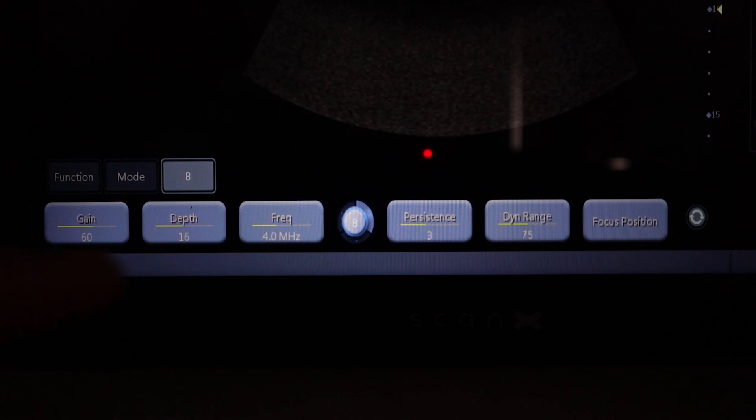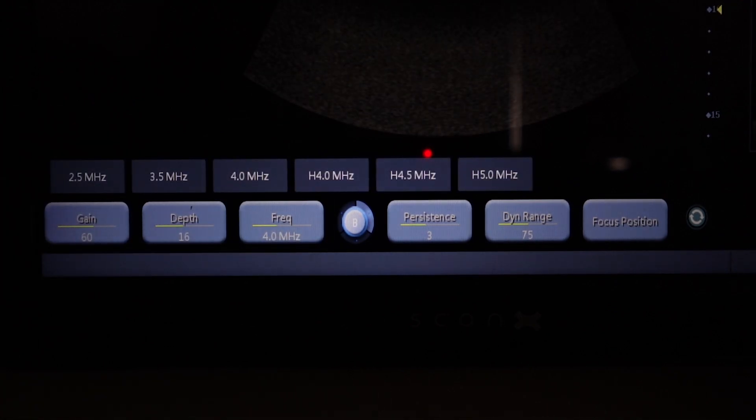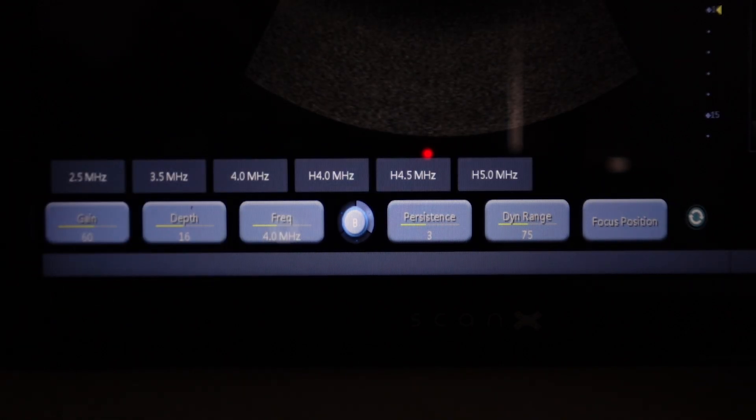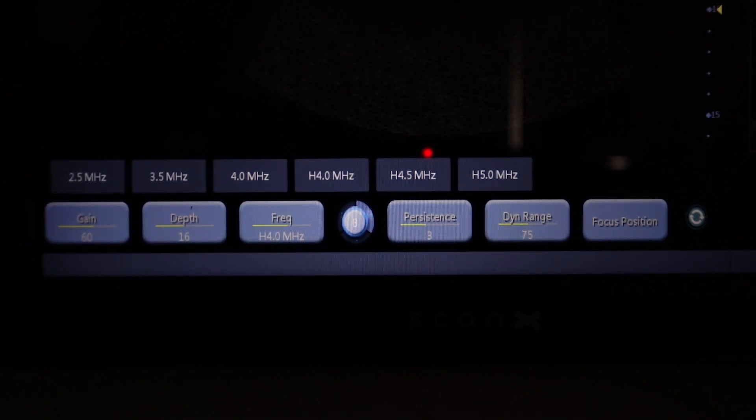As you can see, we are currently scanning at a frequency of 4 megahertz. If I click frequency, this will bring up different options. Any option with an H next to it is your harmonic imaging mode. So I can simply click frequency and select H 4 megahertz. I am now scanning in harmonic imaging mode.